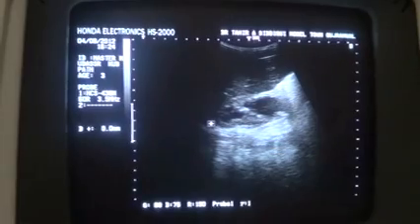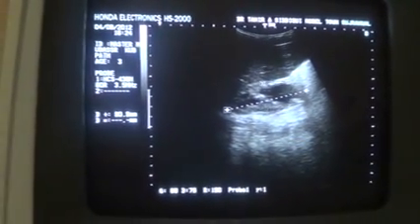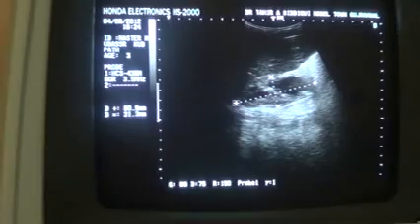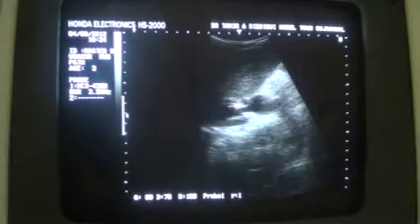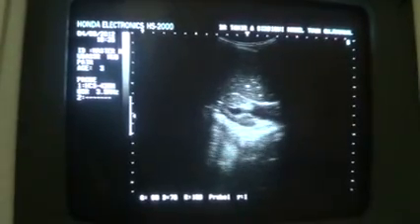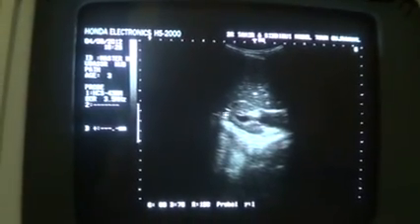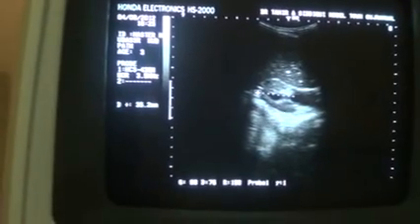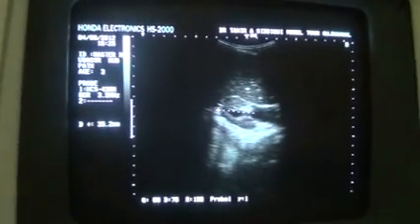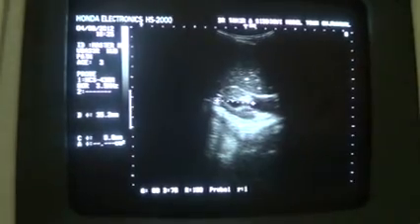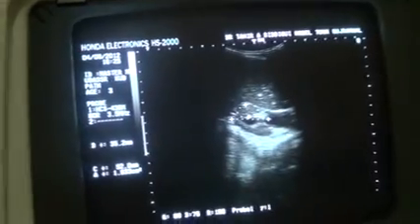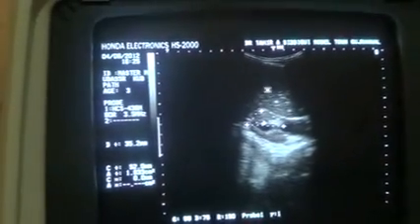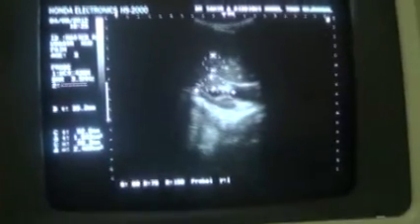It measures 8.0 cm in length, 3.1 cm in anterior-posterior diameter, and 3.5 cm in transverse section. This is the transverse section of the right kidney. Note that the parenchymal echogenicity is raised as compared to that of the adjacent liver parenchyma.